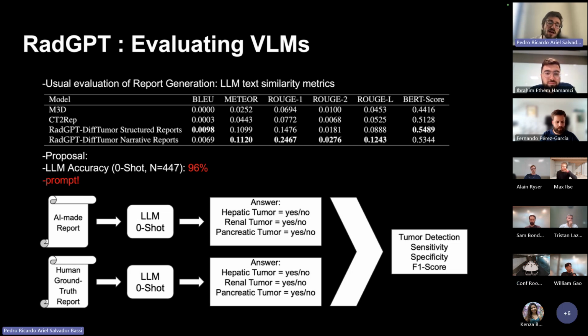That's interesting. Our fear of fine-tuning the LLM was, it's an open question: will it generalize well to new hospitals or not? Because I think it mostly depends on your data set. If you have a very large data set with many institutions and reports from many institutions, then yes, fine-tuning will be great because you can learn from this, and because you have this big data diversity, you can generalize well. But if you have a single hospital, I would be a little bit afraid that if you fine-tune, you may lose generalization to new hospitals in the future.